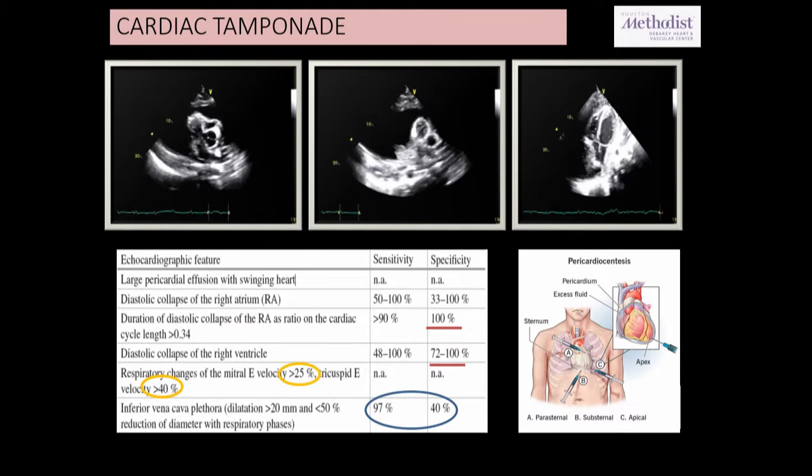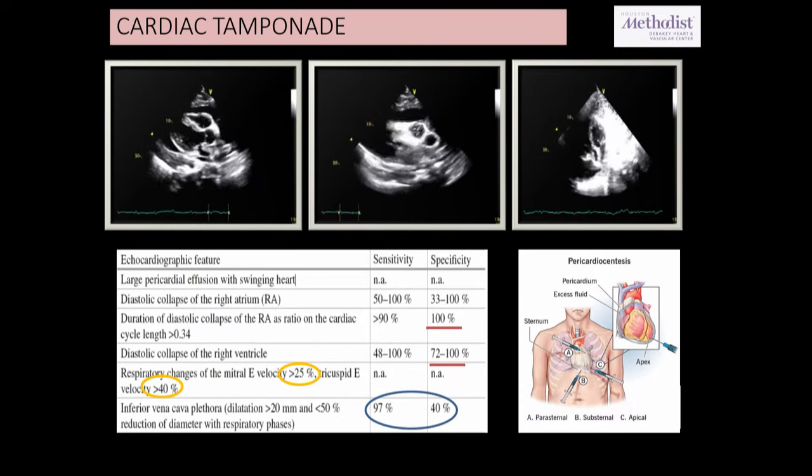So always remember, echo-guided pericardiocentesis is the definitive first line of therapy. And if you can, try to measure the maximal dimension of the pocket and then go from there, right? So usually there's a 97% procedural success rate and sometimes a 4% procedural complication rate.